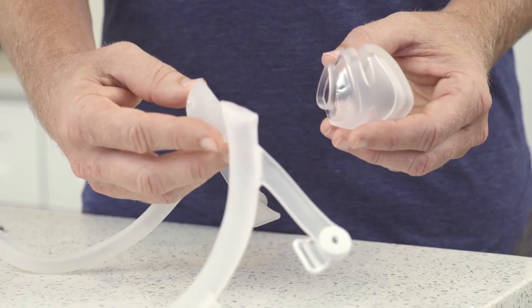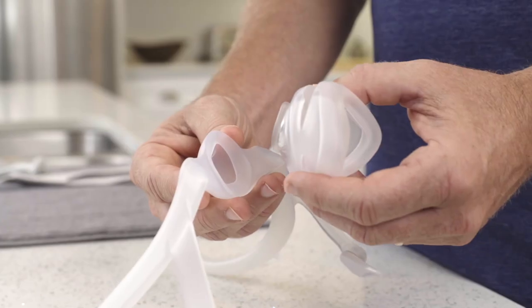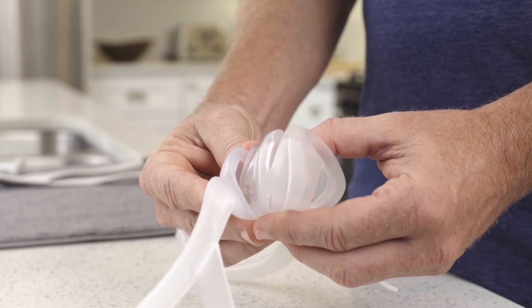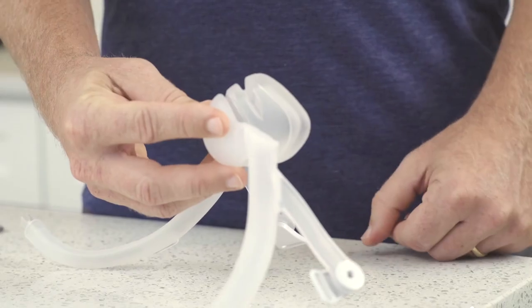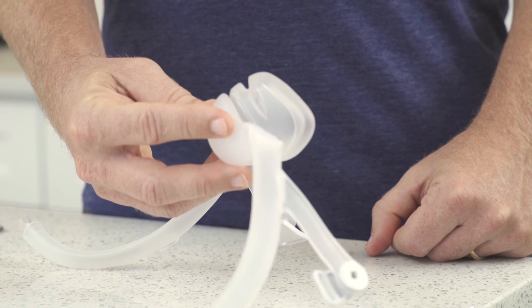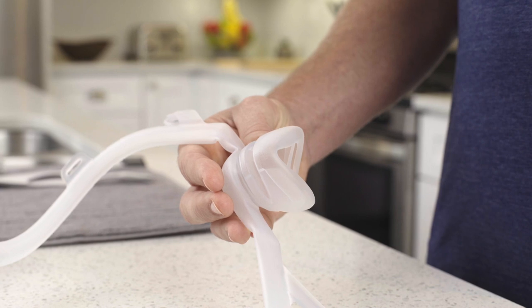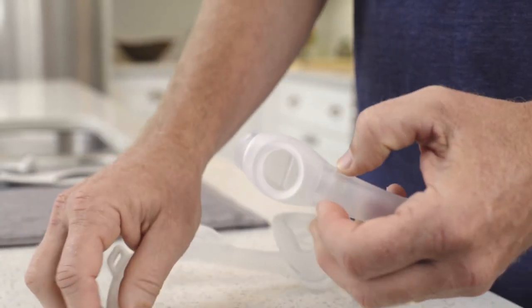To reassemble the DreamWisp mask, first align the cushion and frame. Notice that the openings have a similar shape. Attach the cushion to the mask frame by resting one edge of the frame against the cushion and rolling it into the opening. Make sure the raised edge of the mask cushion is fully inserted into the mask frame. Click the sizing connector into the mask frame tubes.